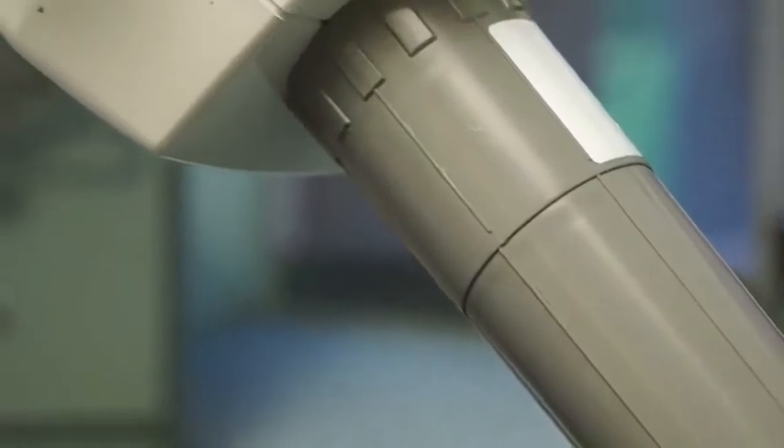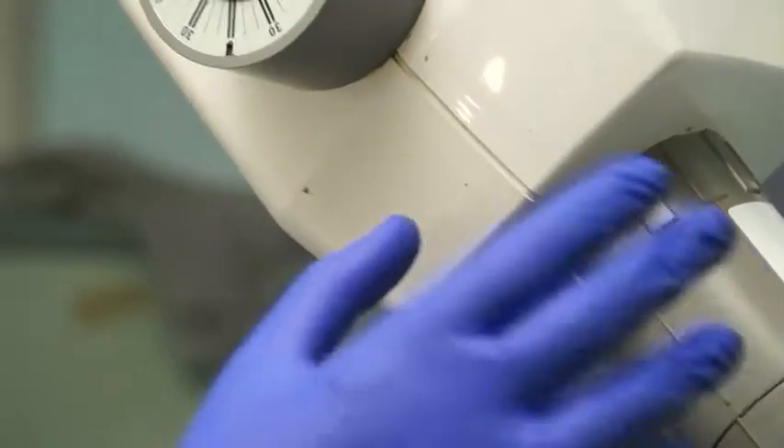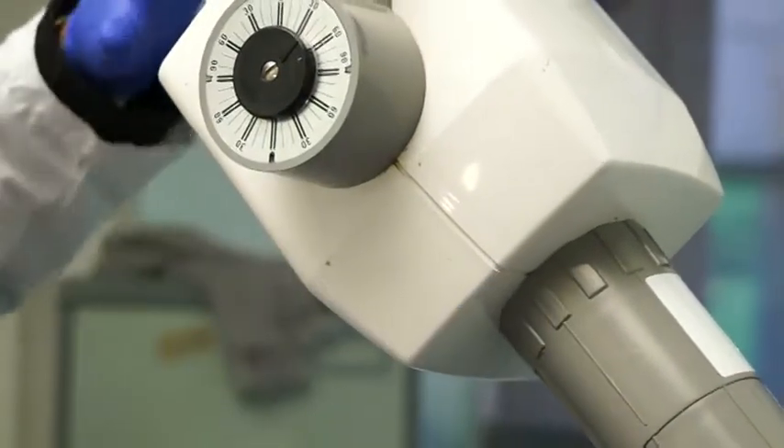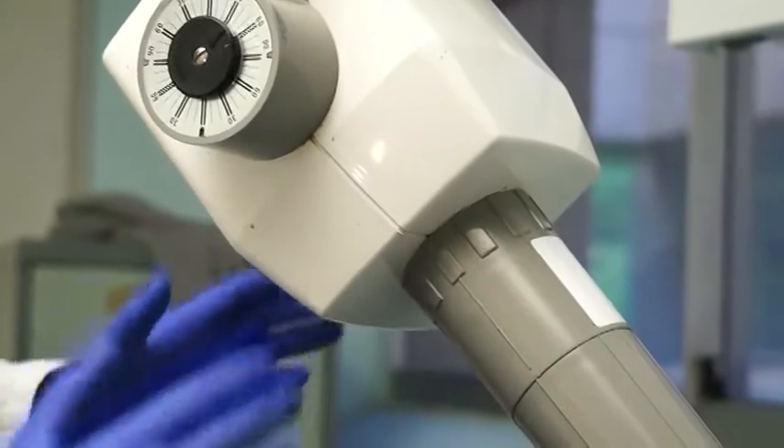So in the maxillary region, you can see that in all views the tube is facing down. We say that if we do the maxillary region, it is a positive vertical angulation.